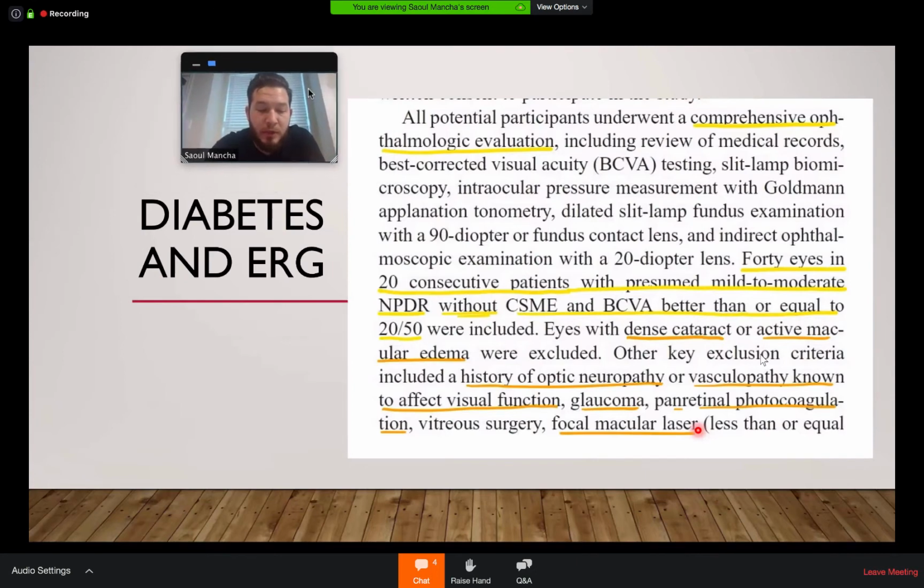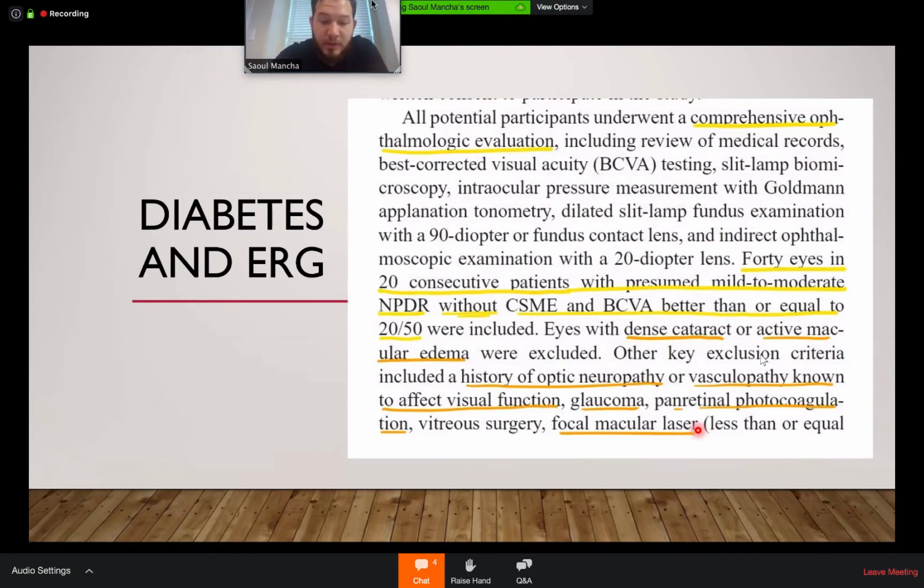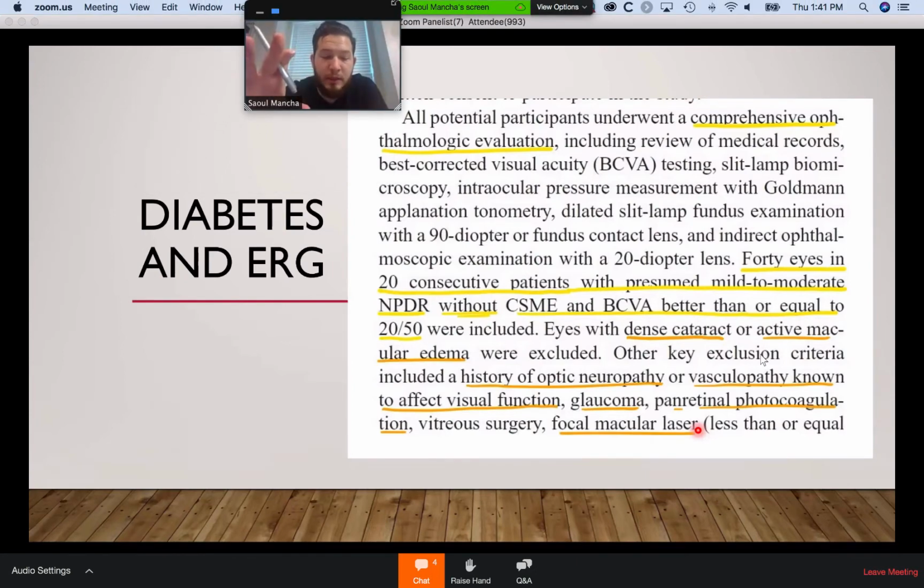So the researchers used the multiluminance and the fixed luminance electroretinograms in the study. The fixed luminance electroretinogram is going to be a full field flash stimulus of a known and constant luminance throughout the testing procedure, while the multiluminance, as you might have guessed, is one where the luminance value changes, and those are going to steadily increase as the duration of the test occurs.